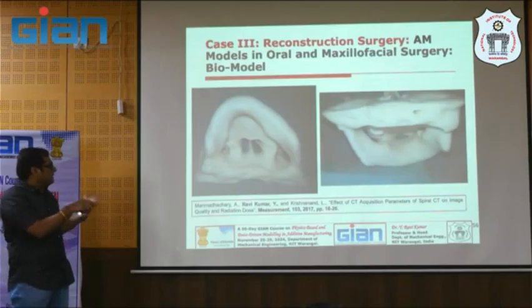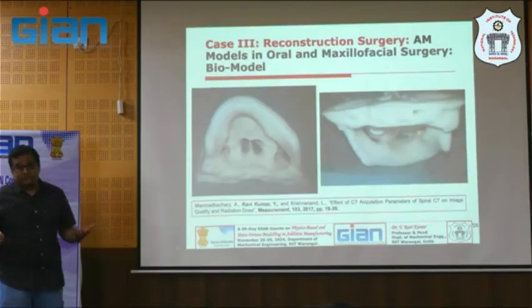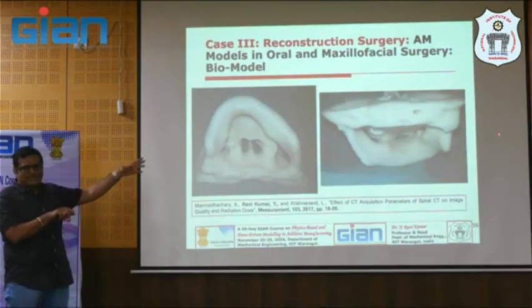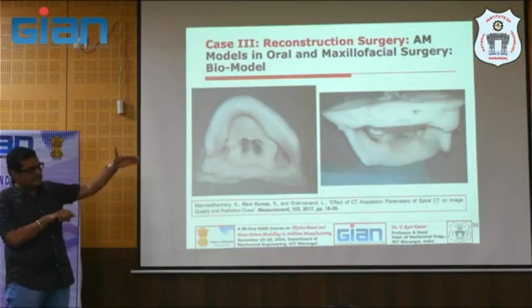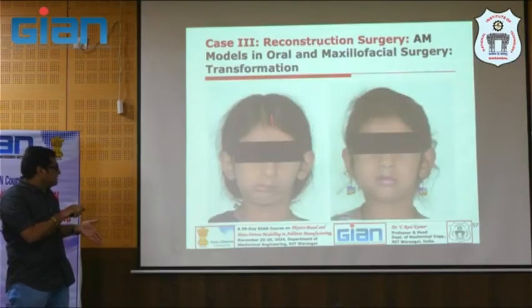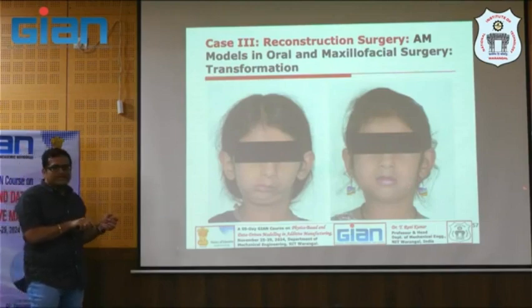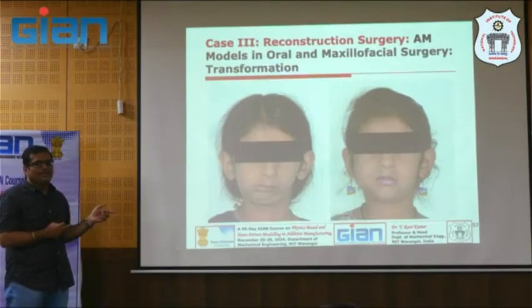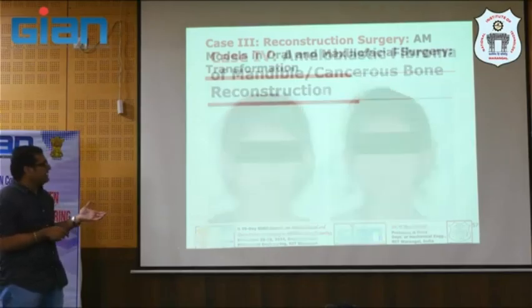So it will vary from patient to patient, right? And for her case, we can do all those vector calculations. What could be the twisting angle, how much we need to twist, and how much we need to stretch that bone, right? You can see this is before the surgery and after the surgery. But still we can notice some kind of asymmetry here. You are correct. The reason is that bone growth is vigorous up to the teenage years, but she is 8-9 years old. Now it has been overcorrected. Once she turns 20 years, the final correction should be done.